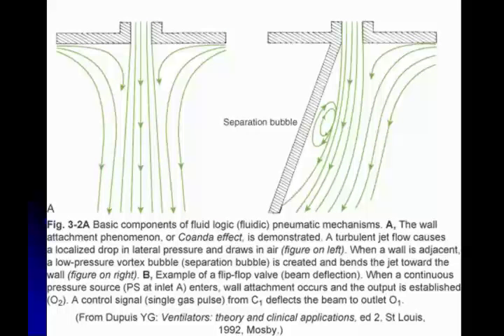This is the concept of fluidic logic. Did you ever, when you're making coffee, you got the coffee pot, you're pouring it into your cup, and it spills, drips. That mechanism whereby the fluid attaches to the coffee pot and drips on, that's called wall attachment theory. That's fluidics. That bit of coffee should never hang there, but it does because of the pressure changes that exist. And that's what fluidic logic utilizes, this wall attachment theory.